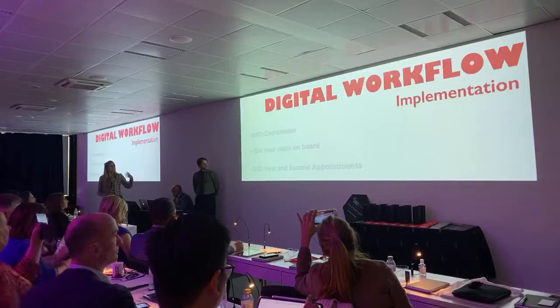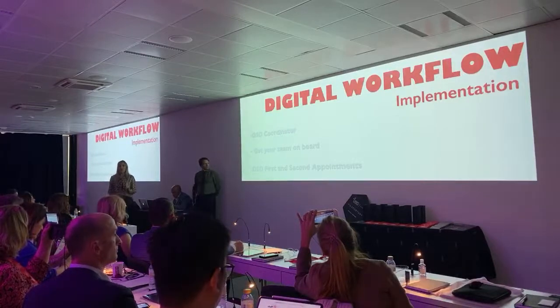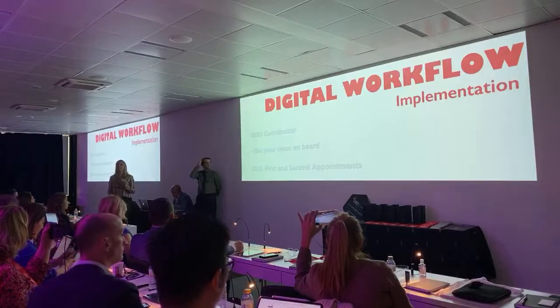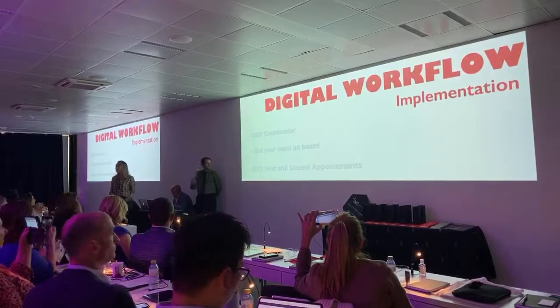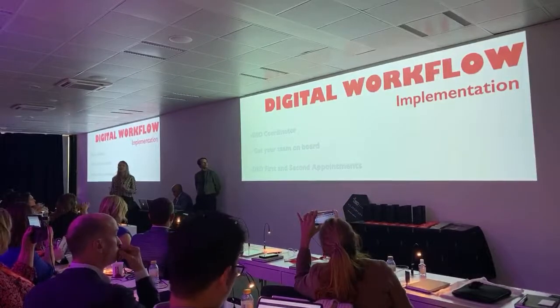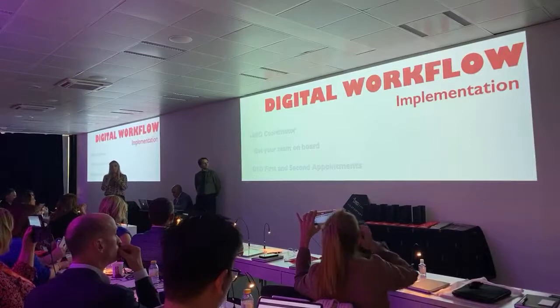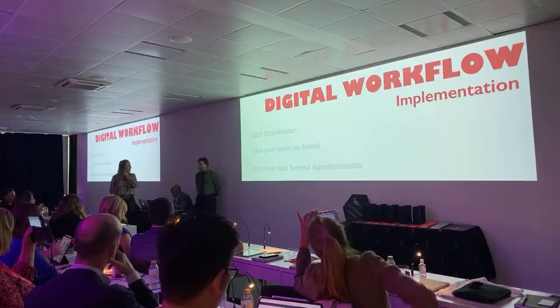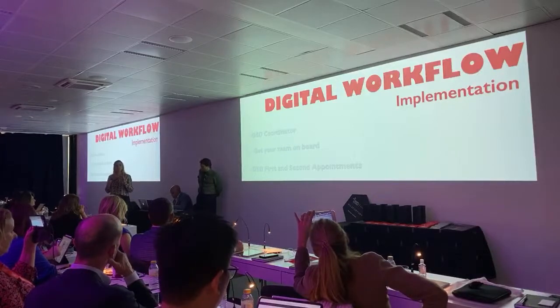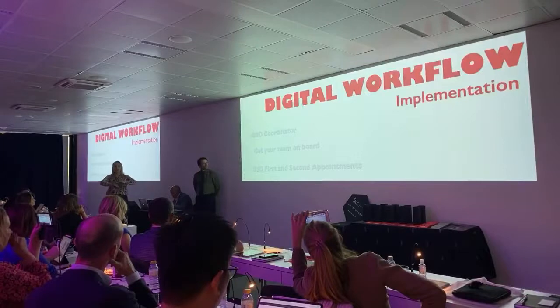Also, make the DSD first and second appointment easier. While those two appointments are complicated, you will not get your team on board and this will not happen. So it needs to be done with a fast team, everybody, like an ensayo, a rehearsal. You need to do this with your team. Save one morning, one Saturday, have a breakfast.